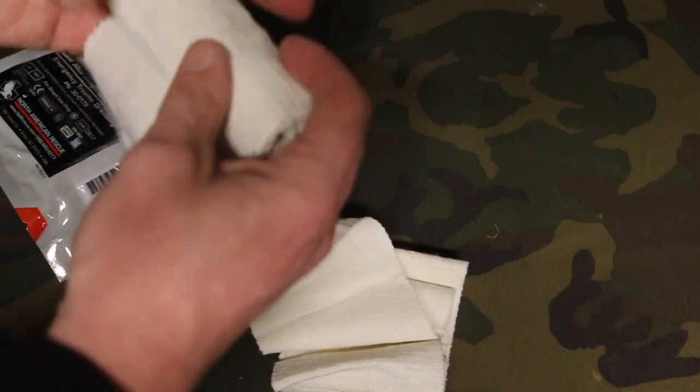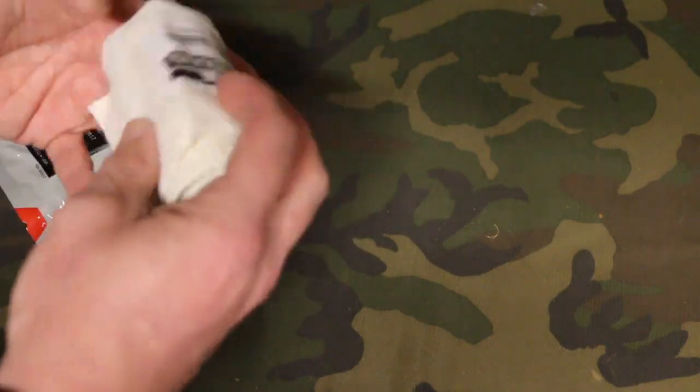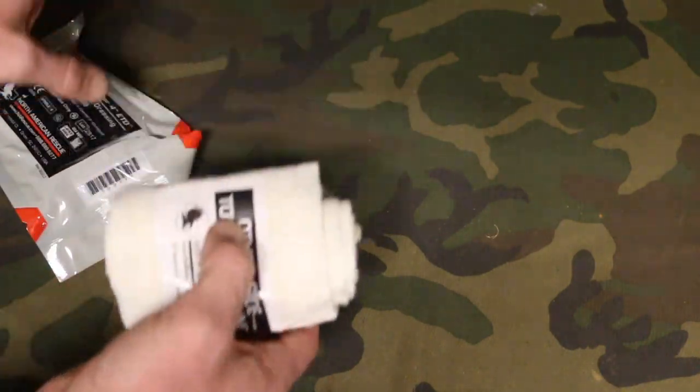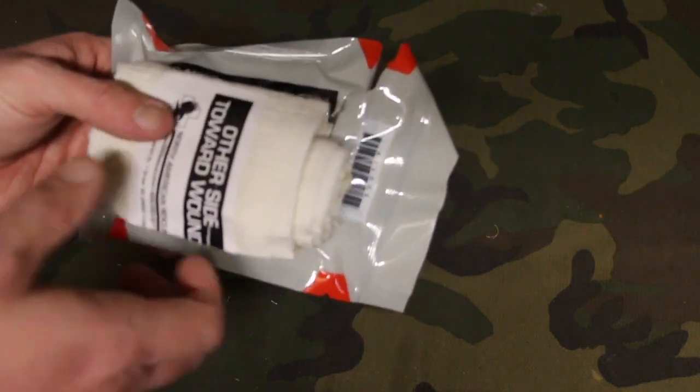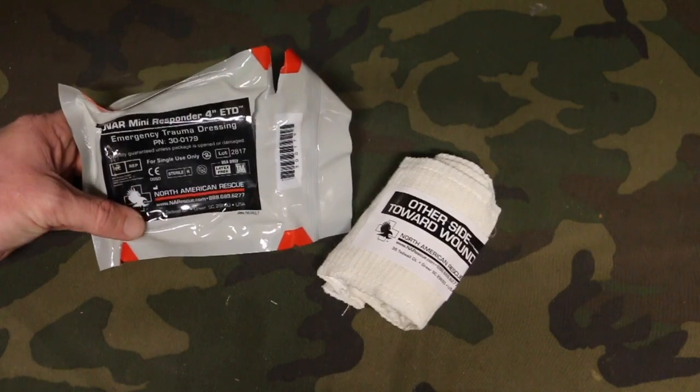This is a great little item to add to your EDC trauma kit or your range bag — even a vehicle kit — because it's really small and you can do a lot with these particular bandages. We have them in stock ready to ship at MedicalGearOutfitters.com.